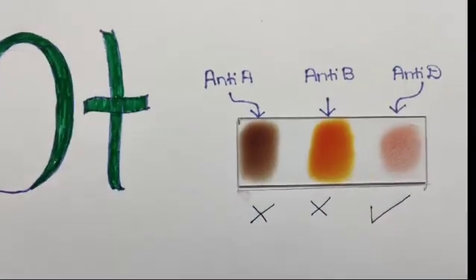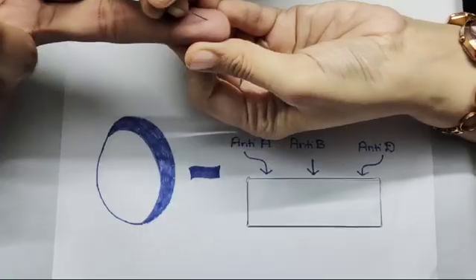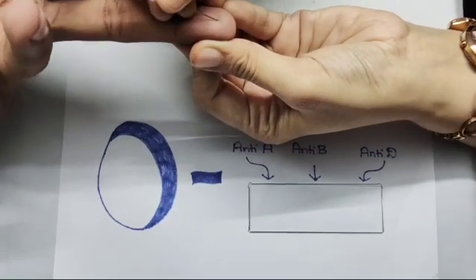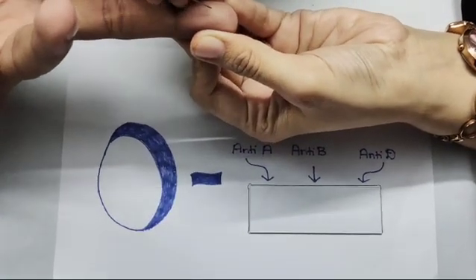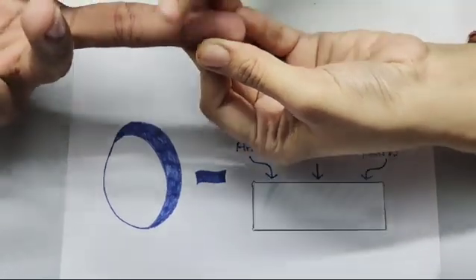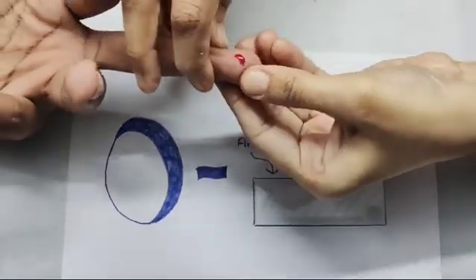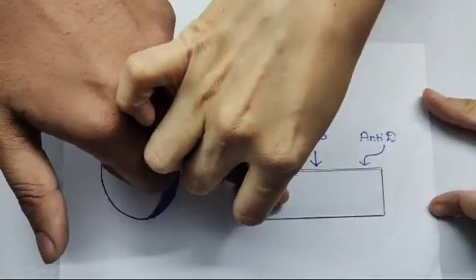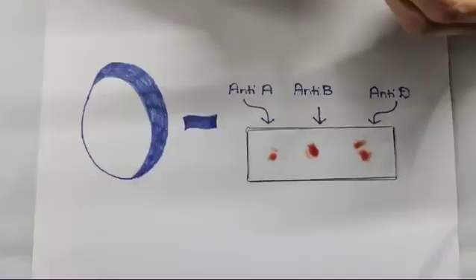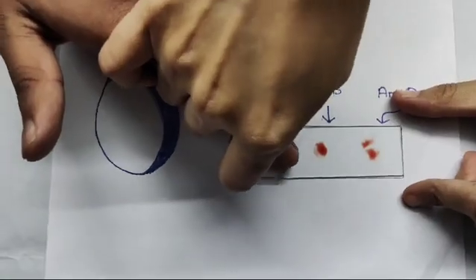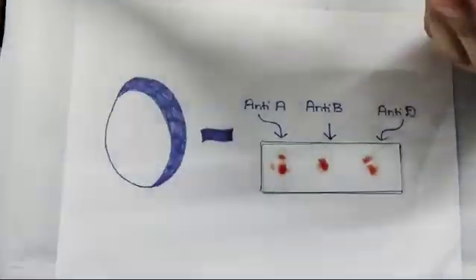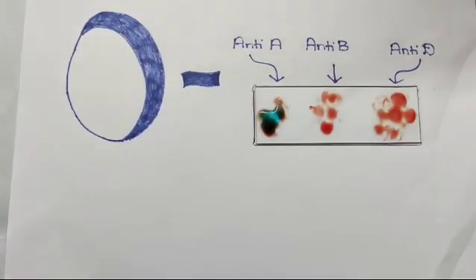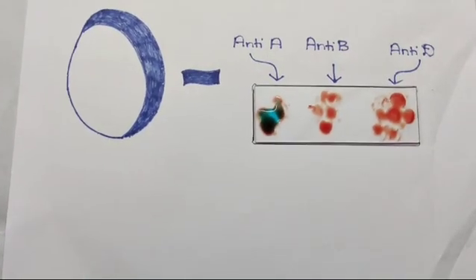Do the same for O negative blood group. Here also, no clotting will be seen in anti-A and anti-B, which means both antigen A and antigen B are absent. It is O blood group.